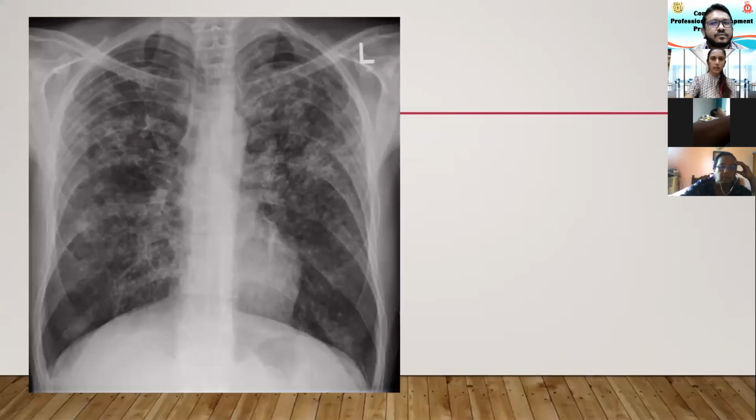What is ground glass appearance of a chest X-ray? What are the examples? Ground glass, if you think of it now, is commonly seen in COVID. Ground glass is like a veil-like opacity, a diffuse opacity in the pulmonary areas. That means it's a veil-like opacity; you can get patchy opacification, but it will be a homogeneous increased density rather than consolidations.